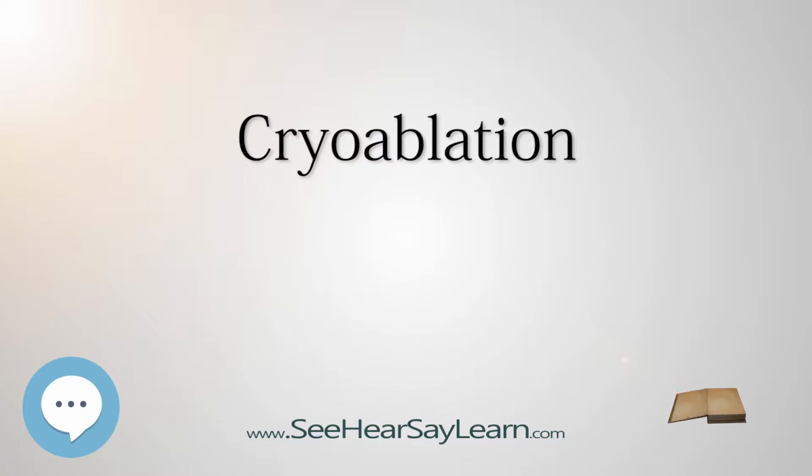Bone cancer. Cryoablation has been explored as an alternative to radiofrequency ablation in the treatment of moderate to severe pain in people with metastatic bone disease. The area of tissue destruction created by this technique can be monitored more effectively by CT than RFA, a potential advantage when treating tumors adjacent to critical structures.